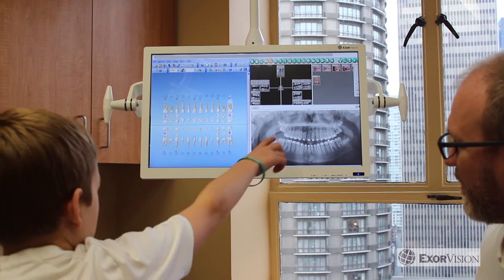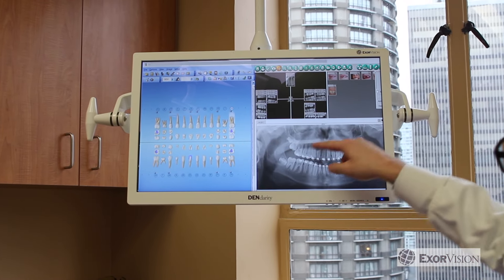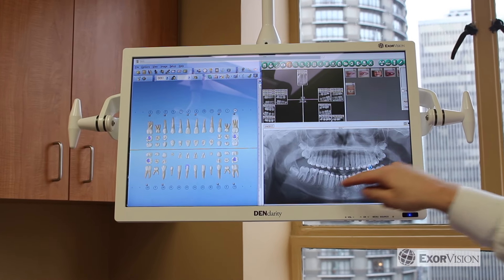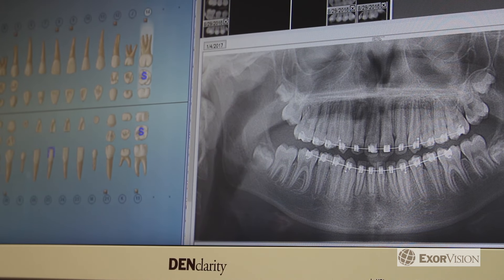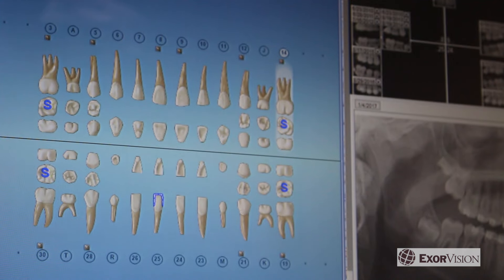But just because it's low voltage doesn't mean it has a low image quality. In fact, our dental grade monitors have a 60% larger usable area, higher brightness, and better image quality than 19-inch consumer grade monitors, so you'll be able to increase productivity, see more clearly, and diagnose more accurately.